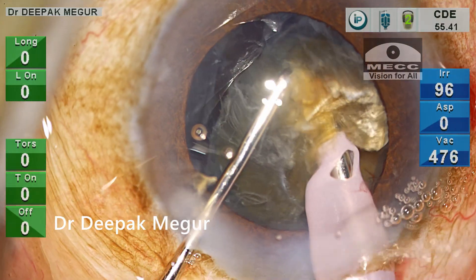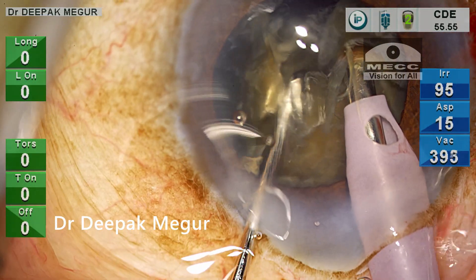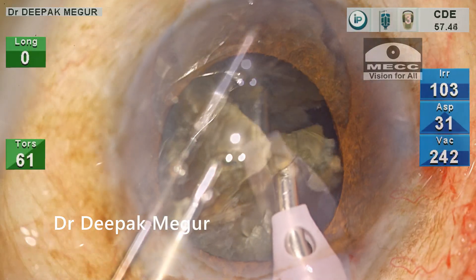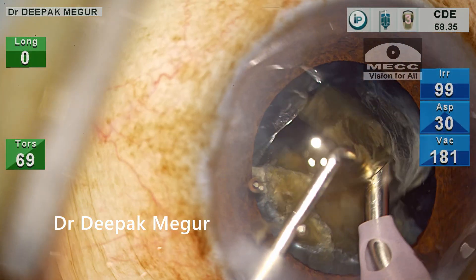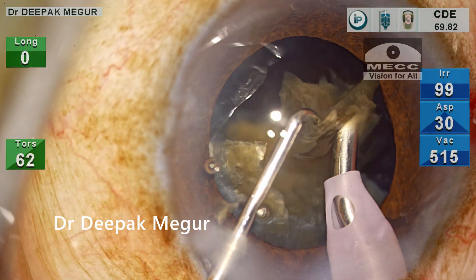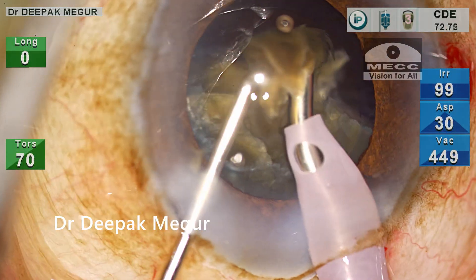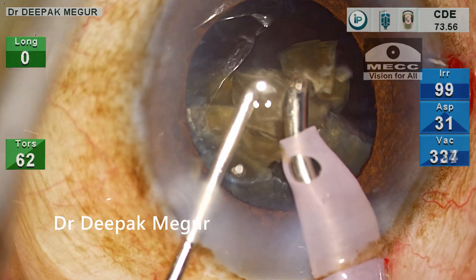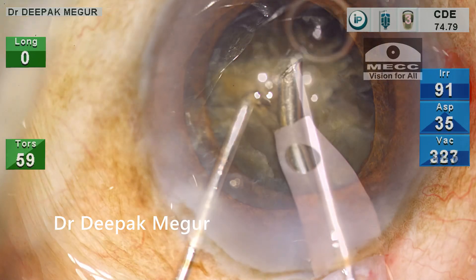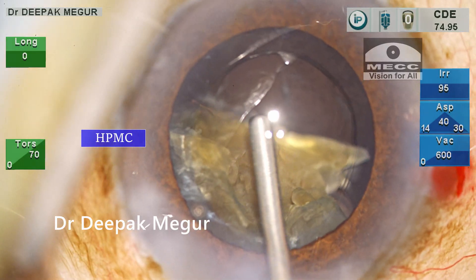The remaining part of the hemi-nucleus is again chopped into smaller fragments using progressive chopping and lateral separation at deeper planes. All these fragments are then very patiently and slowly emulsified under great control. It's then time to replenish the OVD — dispersive goes in first, followed by HPMC underneath, a sort of modified softshell technique.